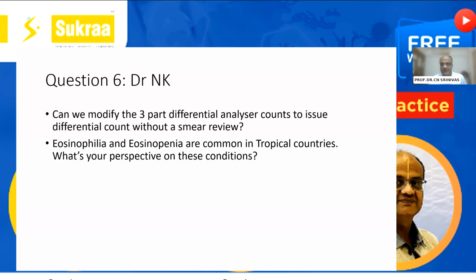That's great, doctor, because most of the time, whenever we see a lot of eosinophils, we get excited and we try to dump it as eosinophilia just because the WBC count is normal. But I think if repeatedly you are getting the same patient with eosinophilia, it's better that we call up the clinician and ask for the clinical details and work up with the flow cytometer to rule out the chronic types of leukemias where the eosinophils are very predominant, just like the basophils. Oh, that's good. So we'll move on to the next question, doctor.